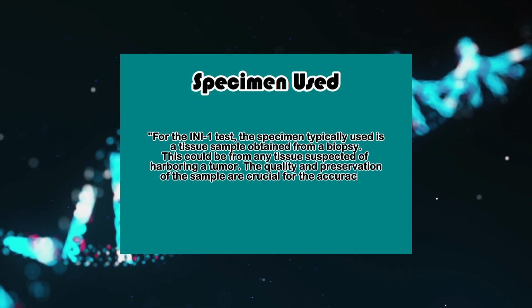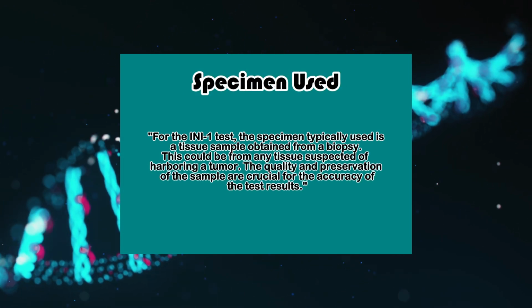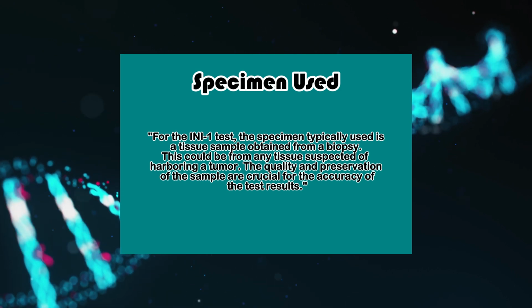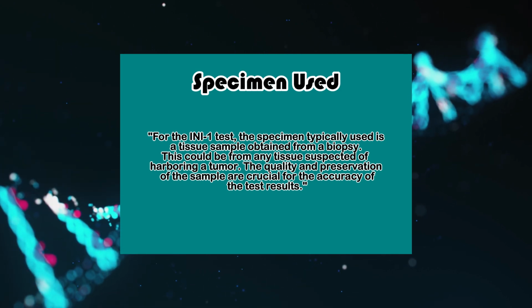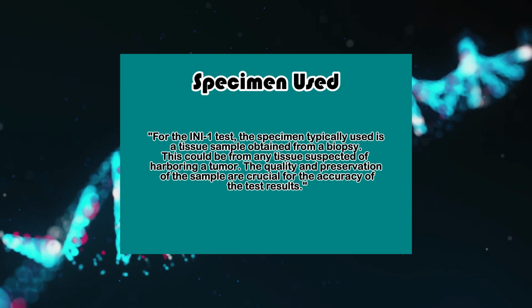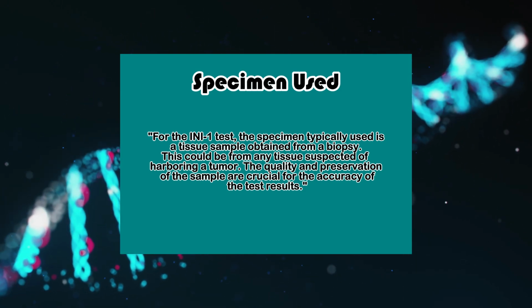Specimen used in the test. For the INI-1 test, the specimen typically used is a tissue sample obtained from a biopsy. This could be from any tissue suspected of harboring a tumor. The quality and preservation of the sample are crucial for the accuracy of the test results.